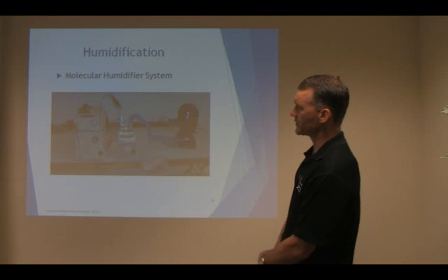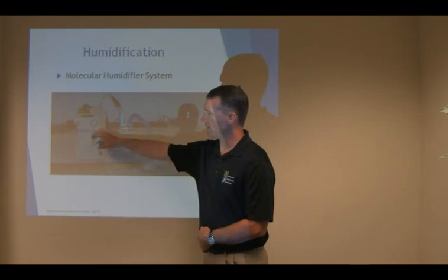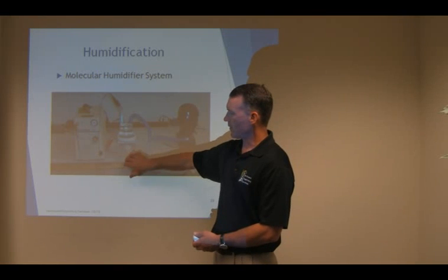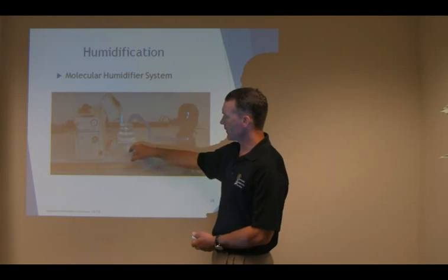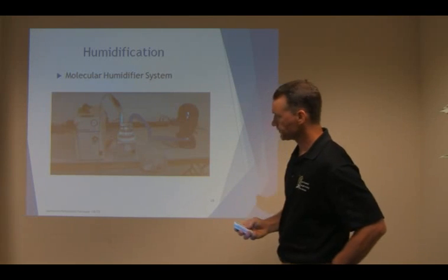And here's our system. Once again, we have our compressor. We want to make sure that our pressure is no higher than 20. This is our percent O2 lock system, or the Venturi mask. This is an MR410 heater, water chamber, and we're literally forcing pressure over top of the water and giving it to our resident.